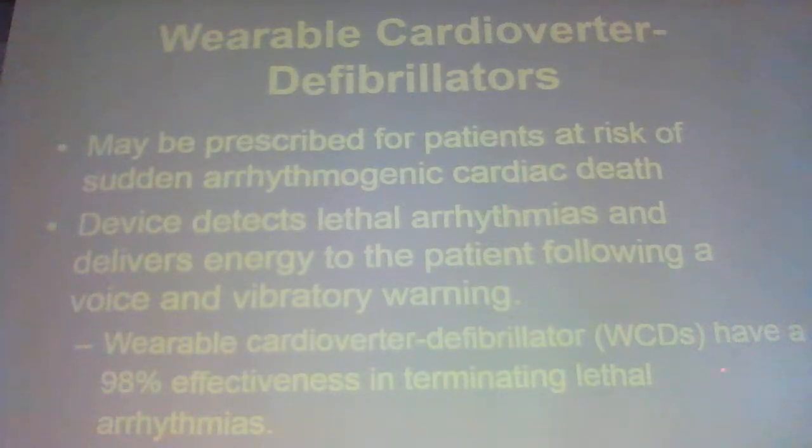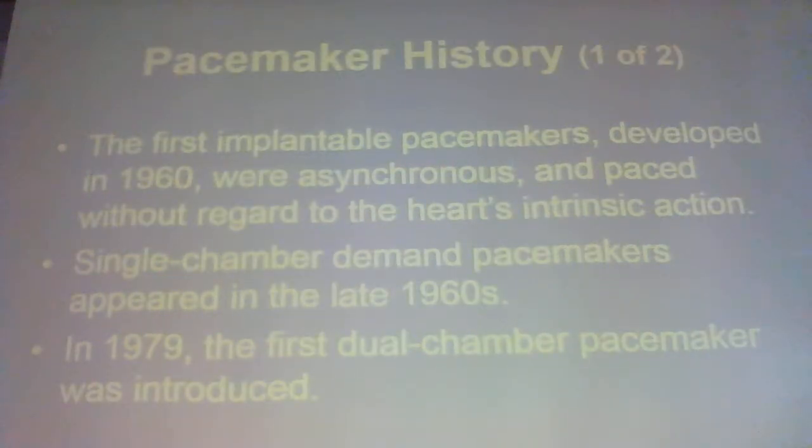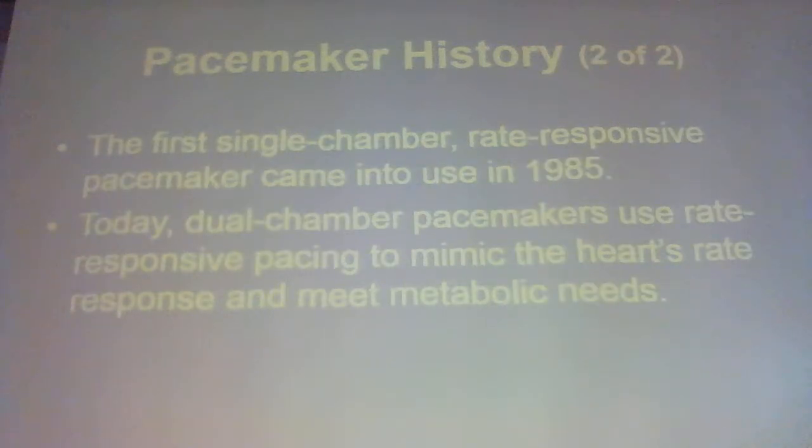Wearable defibrillators are 98% effective in terminating lethal arrhythmias. So, the first implanted pacemaker was in 1960. It was asynchronous and paced without regard to the heart's intrinsic rate. Single chamber demand pacers appeared in the late 60s, and in 79 the first dual chamber pacemaker was introduced.